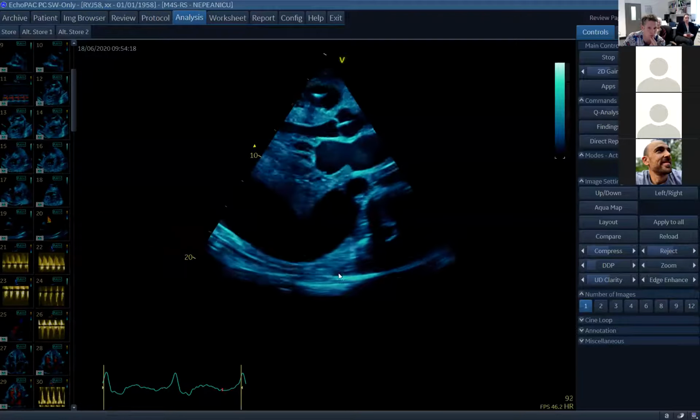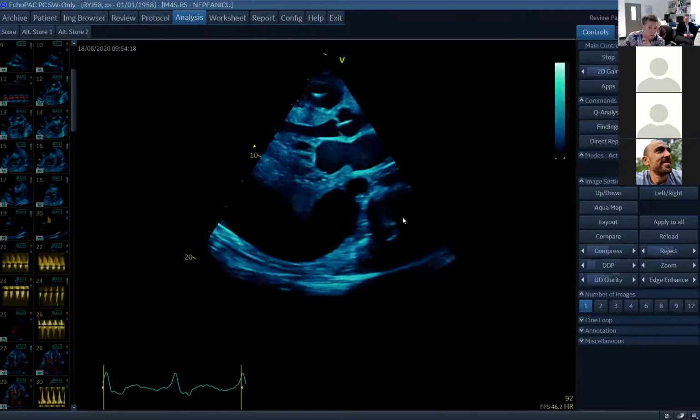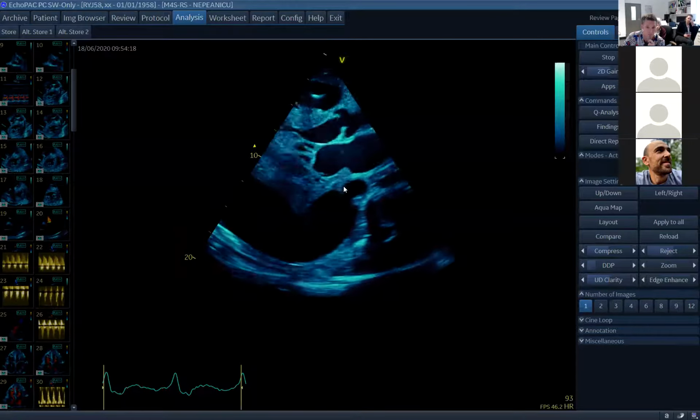No, it's not the vertebral body. The question was, is that the vertebral body? I'm going to say no to that, because we'd expect artifact if there was something behind it. And I think that is a reflection of that. So I don't know exactly what that is. I'm guessing that it could be a stomach filled with lots of fluid potentially. Just very occasionally, if you happen to be scanning through the intervertebral disc, you can actually see the spinal canal at the back.